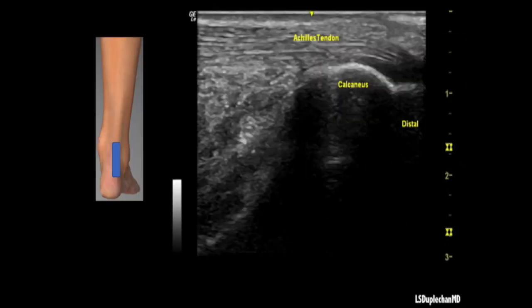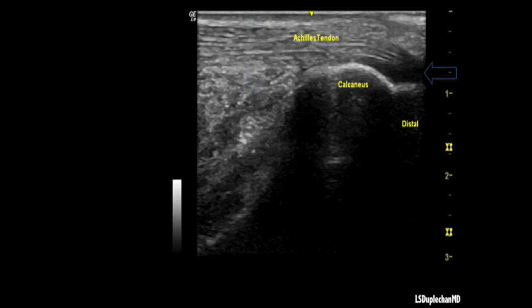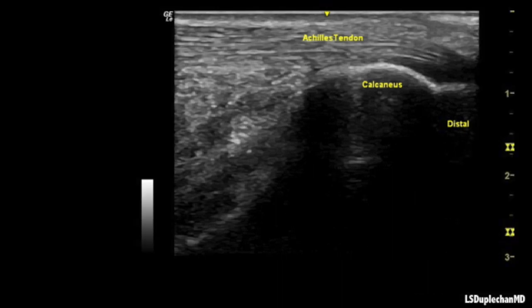The insertion of tendons on bone, seen here with the distal Achilles tendon, is typically out of focus due to its curving path. The simple technique of following the course of the structure with the transducer allows us to fill in the picture by changing the sound beam angle of insonation to correct unwanted anisotropy. As we will see later, the reason I use the term unwanted anisotropy is because some anisotropy can be helpful in discriminating between similar looking structures.